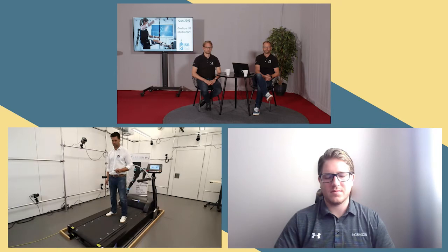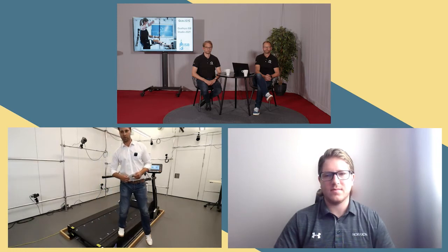So the benefit of a single belt is, if I'm stepping on here, I am completely free in my position. I can walk or run here in this position or here in this position. Sounds obvious, but in reality, even on a treadmill, you're slightly shifting, you're slightly changing your position. In contrast, if there's a split in between, I need to walk left foot, left plate, right foot, right plate, and that will change the gait parameters. Does that answer the question, Patrick?